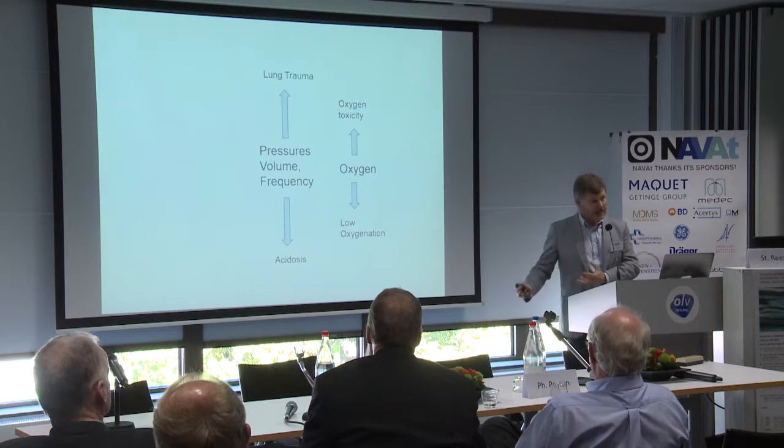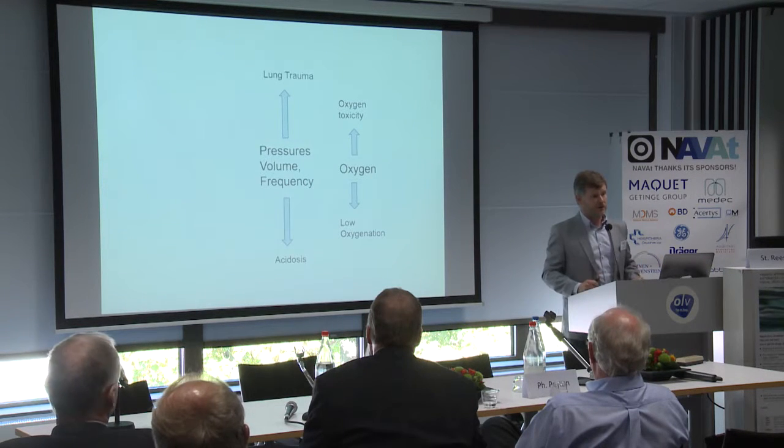But I think we'd all agree. I mean, if we're in an ICU, right, and you have a plateau pressure of 30 and a pH of 7.4, the compromise is badly set, right? If you have a plateau pressure of 20 and a pH of 7.4, maybe that's okay, right? And maybe if it's 30, you want to be considering lower pH levels to make permissive hypercapnia. So there's a balance, and that balance, like oxygen, is related to physiology.